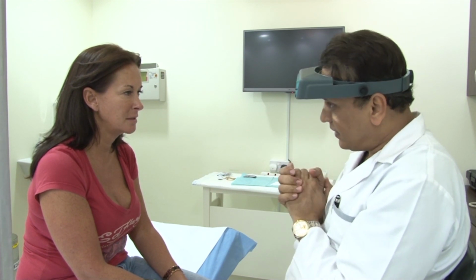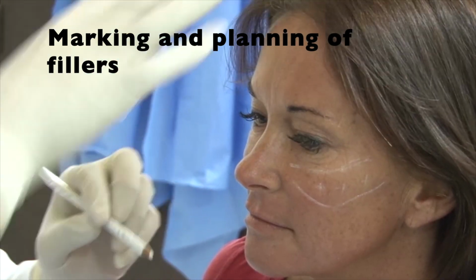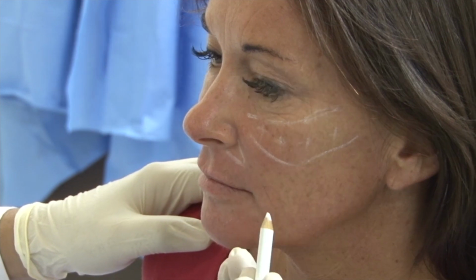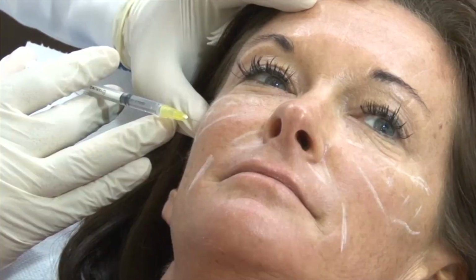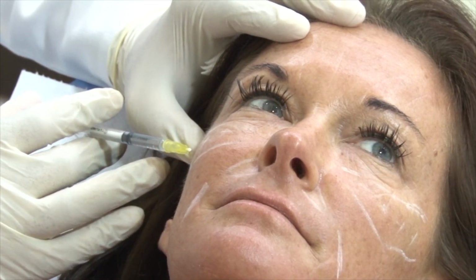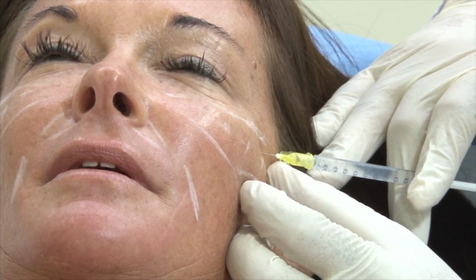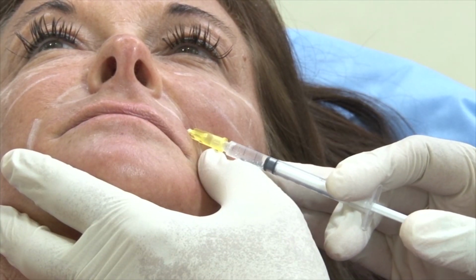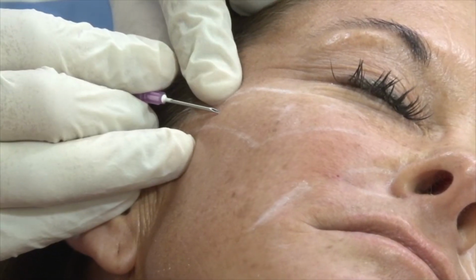Alright, so I'm going to mark the areas where I'm going to use the fillers. So this is the cheekbone that I have marked. I've marked the nasolabial fold, the depth, and I'm marking the superficial creases. Then I give local anesthesia to only the injection port because I'm going to use a cannula. It's not a good idea to give extensive local anesthesia because that itself causes swelling. So I've just injected the port site.